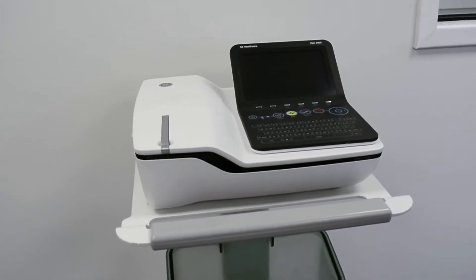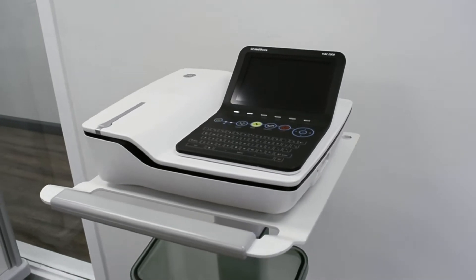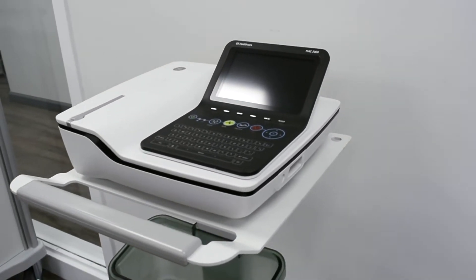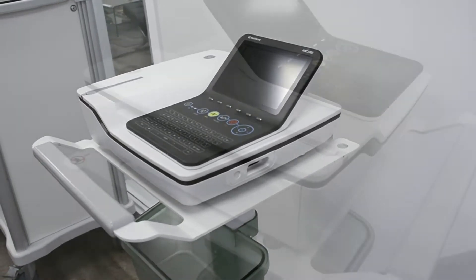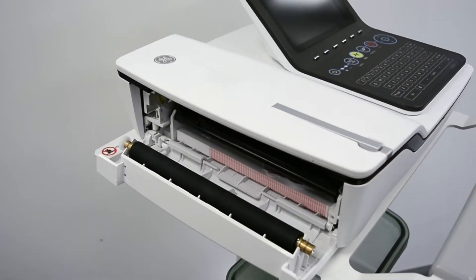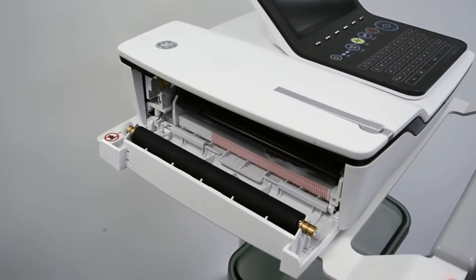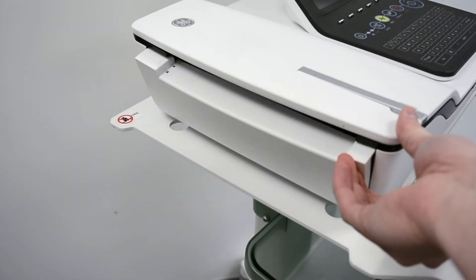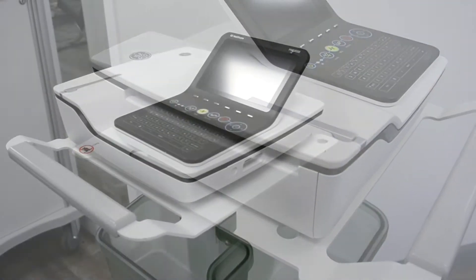The GE MAC2000 EKG is a 12-channel electrocardiograph that can be used on adult and pediatric patients in a wide variety of medical facilities. It can hold up to 200 ECG readings internally, with features to export the readings to PDS and XML, along with wireless capabilities to connect within your healthcare facility.